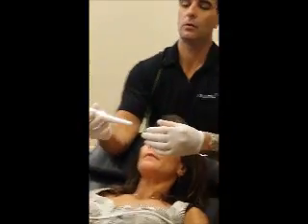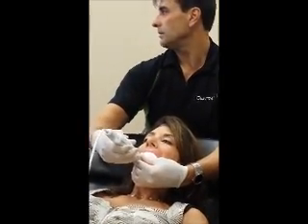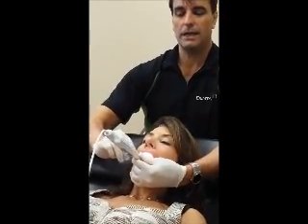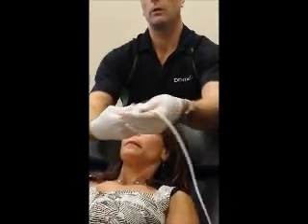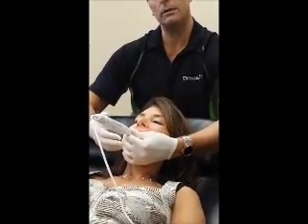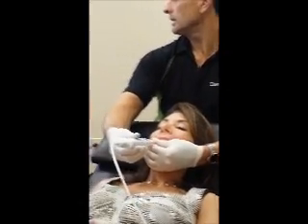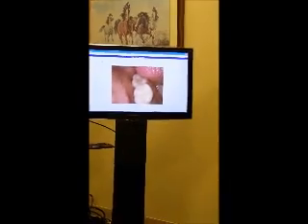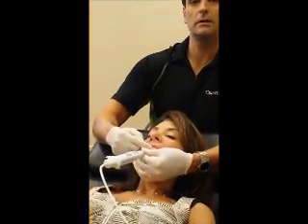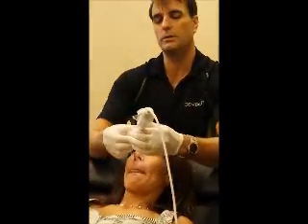When holding for the lower, notice where my fingers are — I've got my middle finger on the capture button to make it easy to capture when I need to, and I'm stabilizing with my left hand, holding the neck of the camera between my thumb and index finger. For the lower arch at a two-to-three tooth view, hand on chin, holding here — I'm fulcruming off of the upper incisal edge. I can just tilt the camera down to see farther back into the posterior teeth, while the camera is still resting on the anterior incisal edge. Then I can simply capture that image. When I freeze the image, I've got the camera really stable, so I know I've captured the image I want.